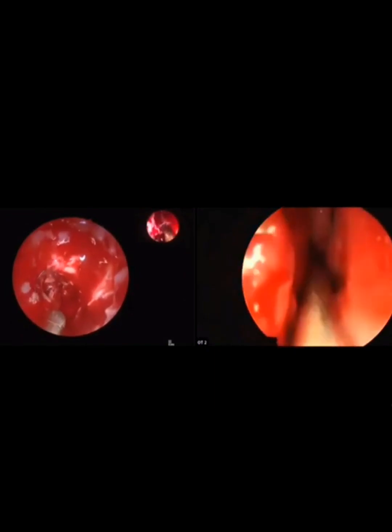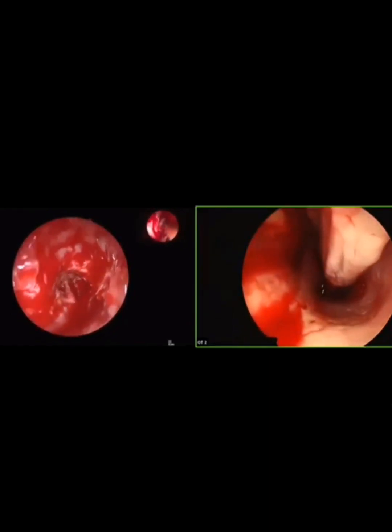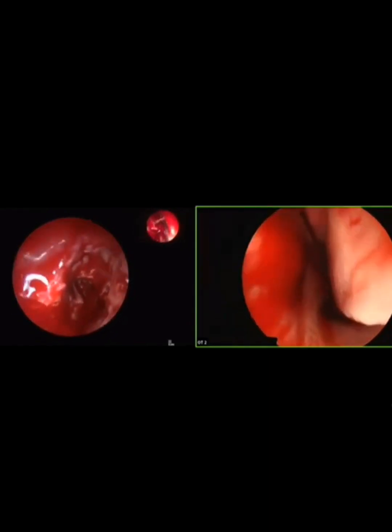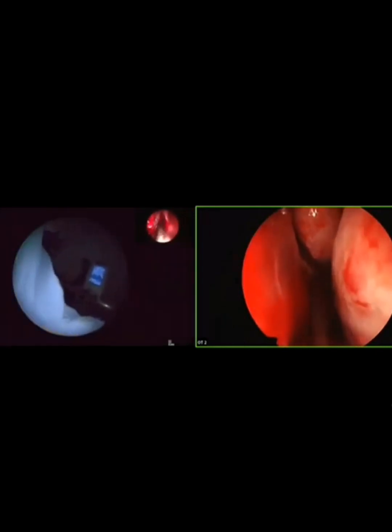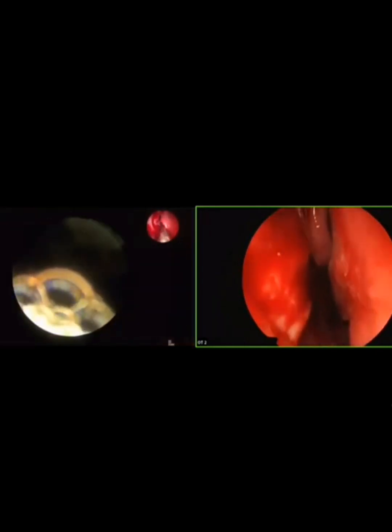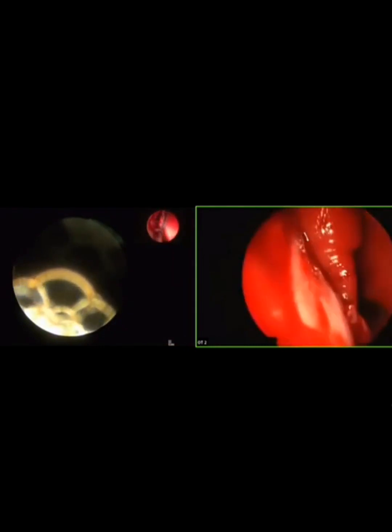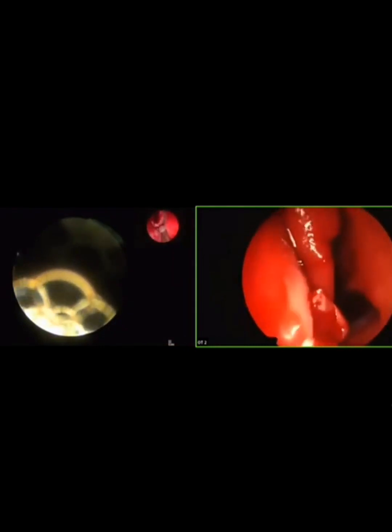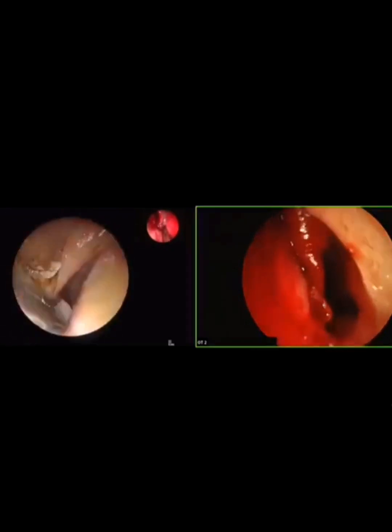After suturing, would you like to put something inside both the nasal cavities? So the splint is one option. Whenever there is a lot of tear on one side or not, we can put a splint. We generally don't do it in all the patients. We do it sometimes. And otherwise, we'll just put packing. Here, there's a minor tear on one side, so we'll just put the packing.